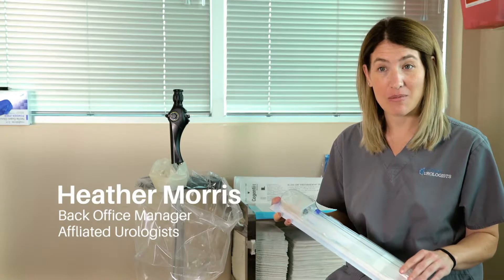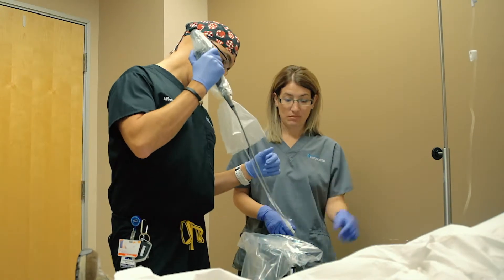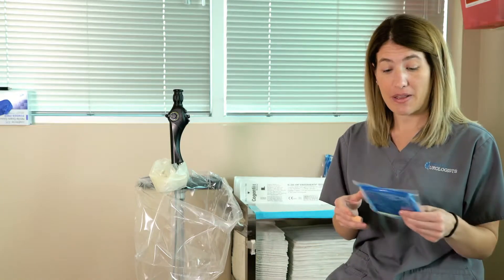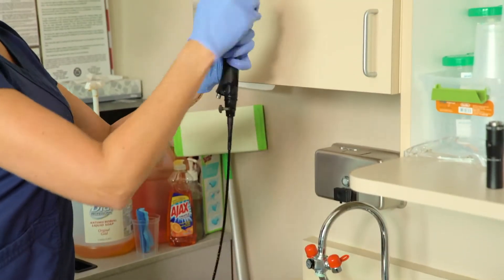This is the sterile sheath that it comes with. Every time you have a new patient you just open it up, load it onto the scope, and it's ready to go. Once you're done with the patient you just unload it by removing it from the scope. You wipe the scope down with the endo wipe — it's an enzymatic wipe — you just wipe it down and then clean it with alcohol after you flush it.